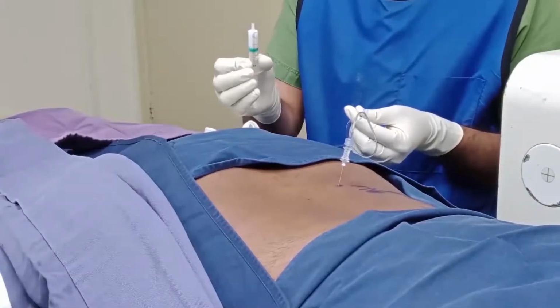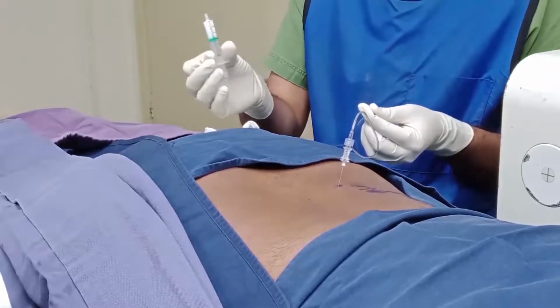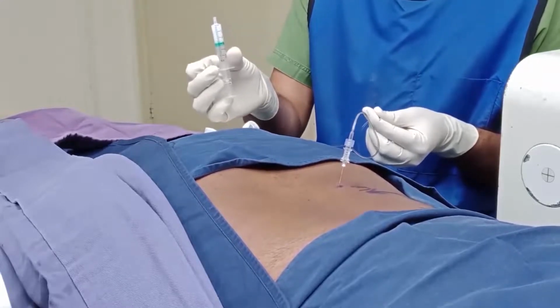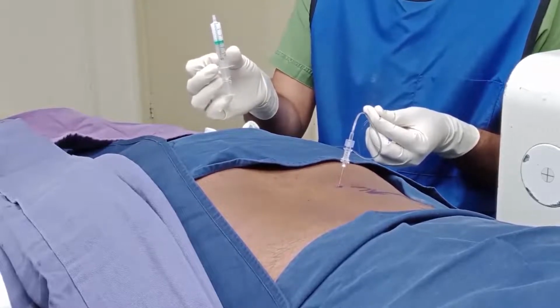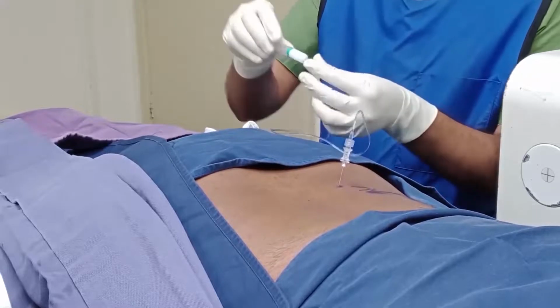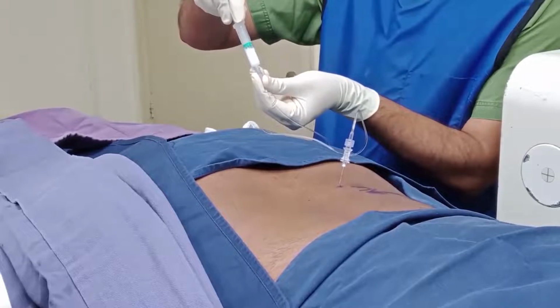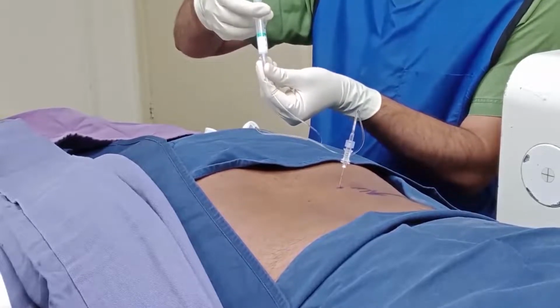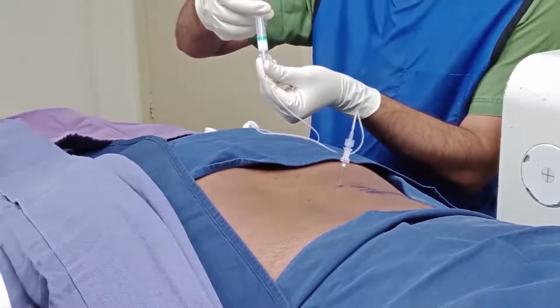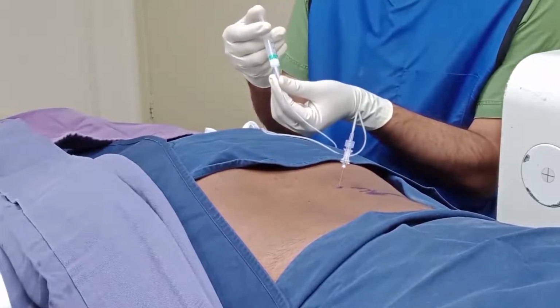The 40 milligram triamcinolone in up to a volume of 3 ml diluted with normal saline is shaken to ensure that the particulates are not settling down, and then is given through the extension line. Aspirating to ensure that there is no blood coming back. As it might be a tight space, it is injected slowly for the patient's comfort.